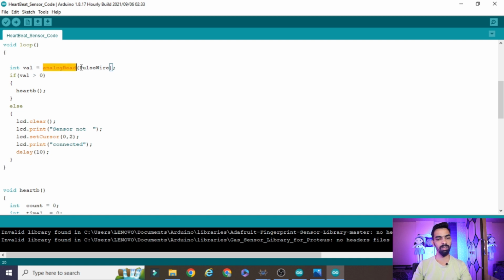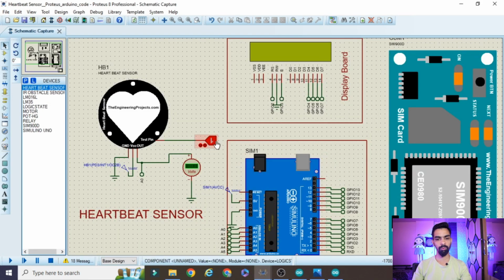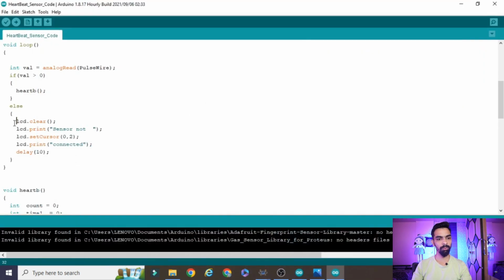At the start we are checking whether the pulse wire input is 1 or 0. How do we read this input? To read this input we use this logic. After the value is read, if the value is greater than 0, that means the value is 1, then we start the heartbeat sensor reading, the high or low pulse. If the output is 0, that means the heartbeat sensor is not connected, so we have to print on the LCD that the sensor is not connected. That's why this else logic will be executed. If the value is greater than 0, you can see the heartbeat function will be called.